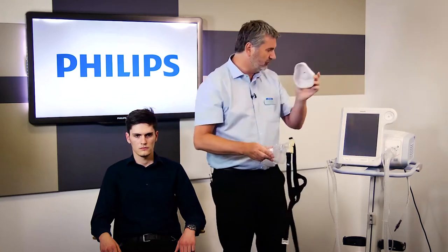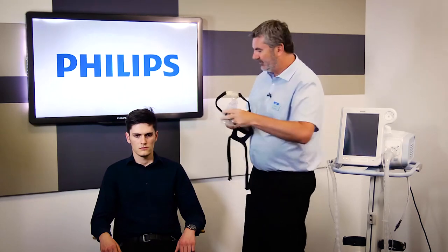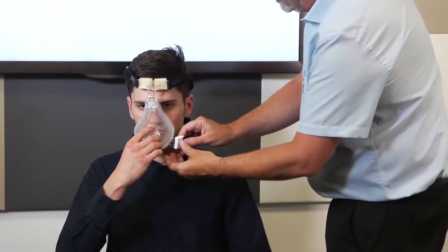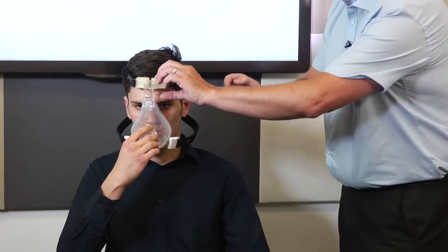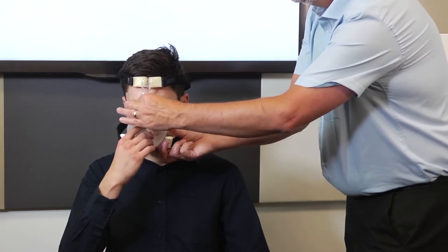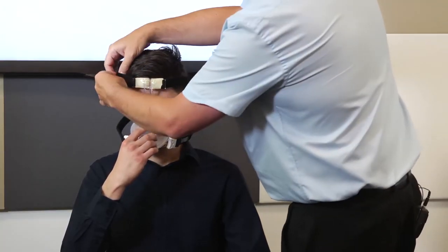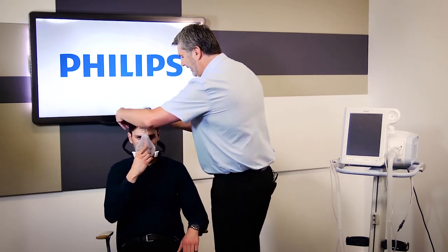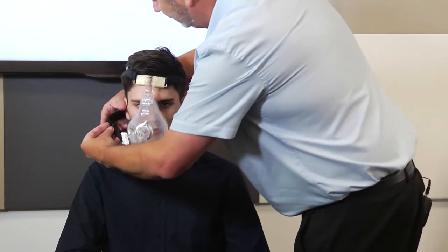If you have this packaging, do keep hold of that — I'll come back to that in a moment. Same principle: two at the top, two at the bottom. We're going to ask our patient to hold it in position once again. Before clipping in, look at the forehead spacer and see if there's a gap between the spacer and the forehead. If there is, just press these two together and that will move the forehead spacer, shifting the pressure from the bridge of the nose onto the forehead. Two at the top first, through nice and gently. At that point, our patient can let go. Then do the two at the bottom just to firm that up.